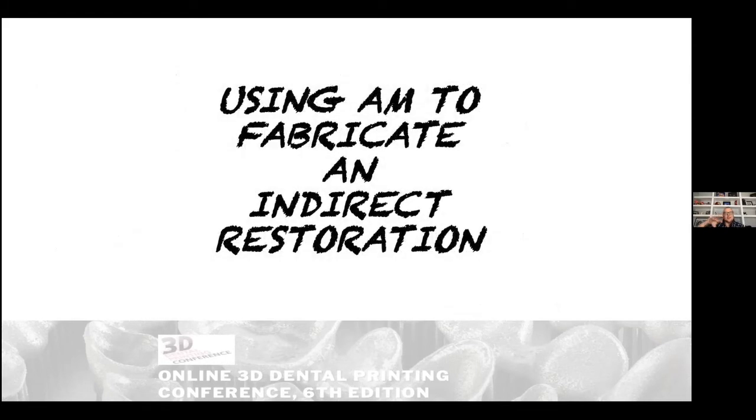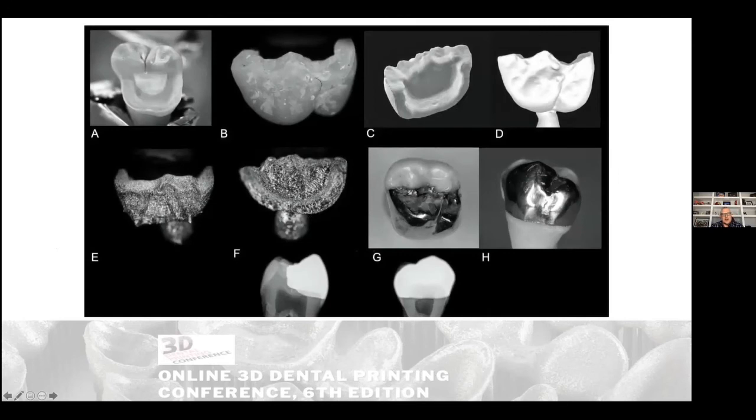So that's the dental implant world. That's what we've done. And I've showed you how we go from kind of getting a lost filling to a final filling. Well, how can we modify the filling world? So let me walk you through quickly here. Here we have a tooth missing a filling. Okay, we've prepped the tooth. So this person came in and is looking for an indirect filling that we chatted about. It's very simple to take a mold of just that tooth if we needed to replicate this. And that's what we've done here.